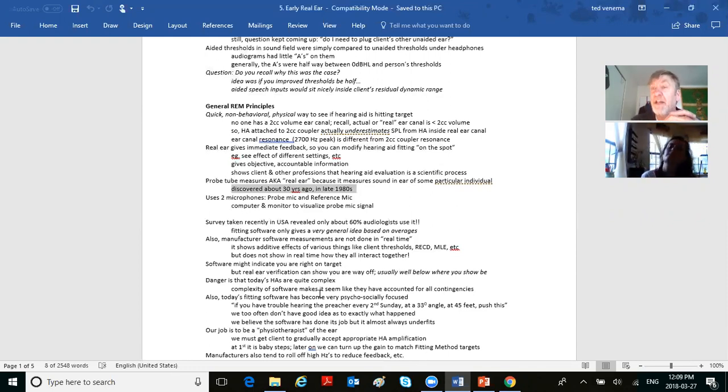It's amazing how many HISs don't use it. It's also amazing how many audiologists aren't using it, because they're sitting there asking the client, how does this sound? How does that sound? And they're operating in the dark.